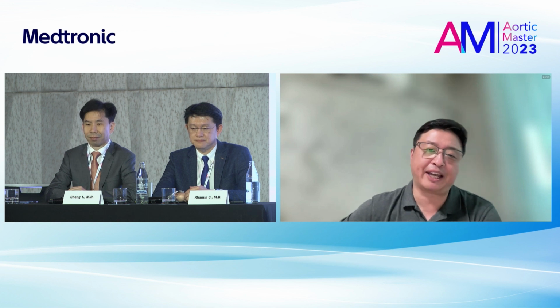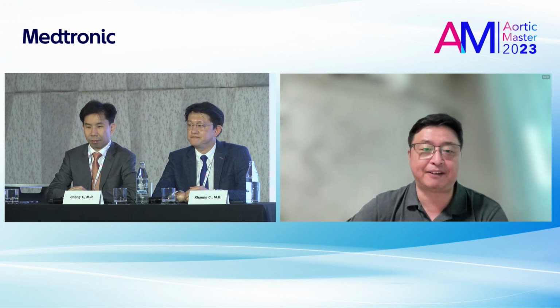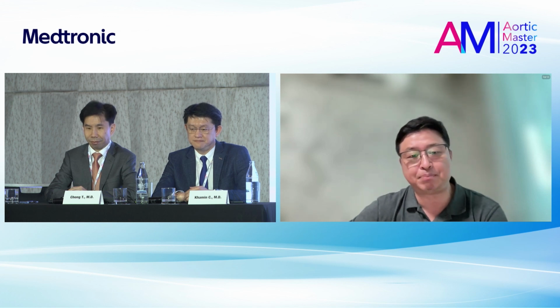I still don't do prophylactic IMA embolization during my EVAR procedures. But Dr. Morikage from Japan routinely does prophylactic IMA embolization during the first EVAR. But I still observe for at least 6 months to treat the type 2 endoleak from the initial procedure.